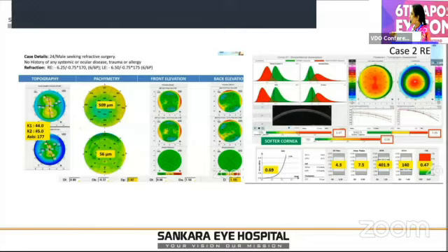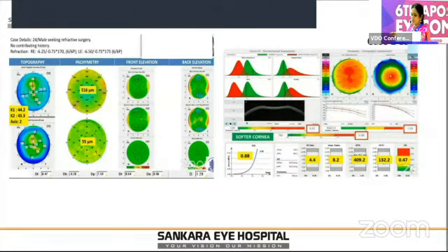normal, absolutely normal Pentacams with 509 microns, with anterior and posterior elevations normal. But here the BAD-D is also normal. The CBI index is around 0.5, which is borderline, whereas this TBI is quite less than 0.29, which is normal. The left eye is also looking the same.